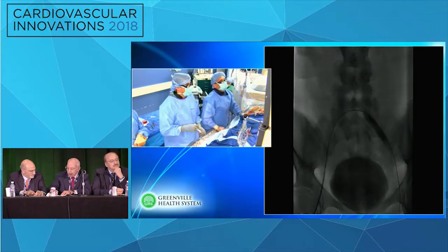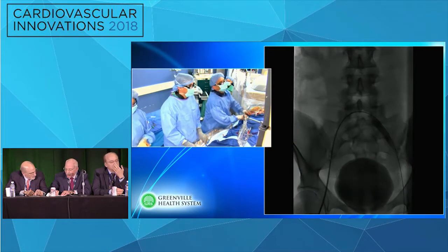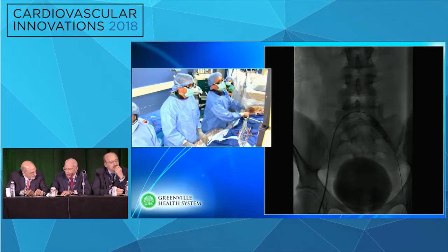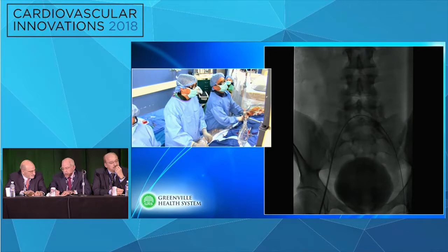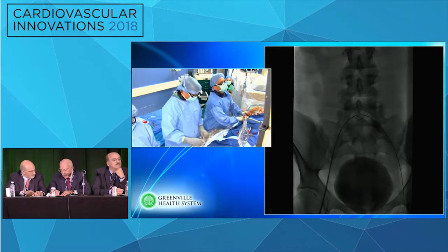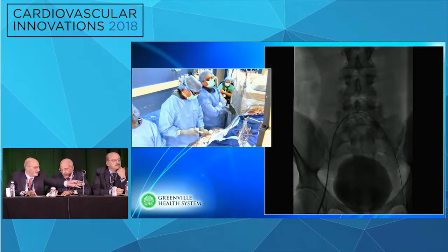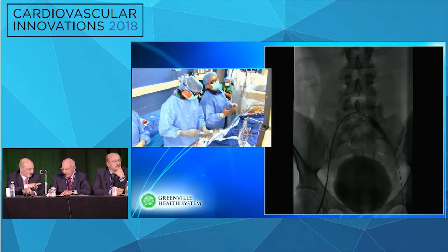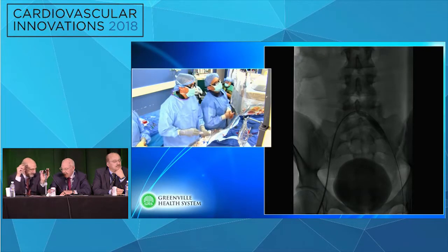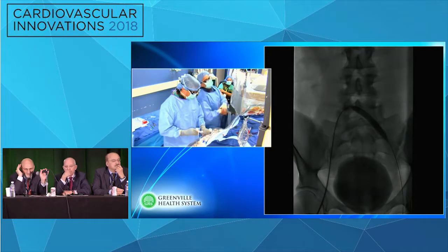So I'm going to walk it up. Give me the longest 12 millimeter balloon we got, please. I'm just going to walk the balloon up and then use that as a frame of reference of what we get here. Go again, please. And then I'm a little bit leery. My original strategy was go to 16 up top. I don't think I'm going to get it to go to 16. I'm going to be happy with maybe putting a 14 in up top here.